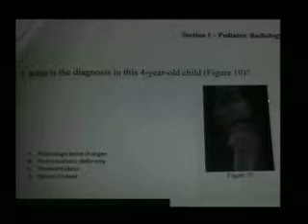Varum? Varus. And for the students, just a quick way to remember, genu valgus: if you put your knees together, it makes an L, that's valgus. Genu varus is bow-legged. This is varus. I'm not sure what follows that. I'm just kind of guessing, but I would say treated rickets maybe, or Blount, some between those.